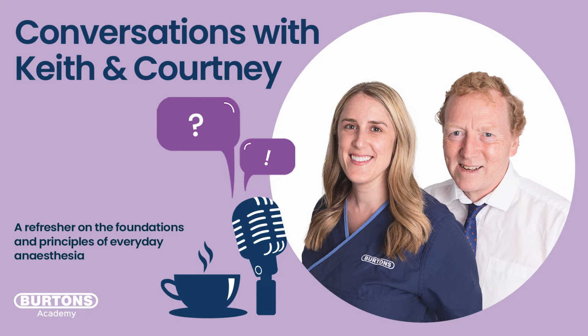Well, yes and no. It does very much depend on the patient involved and also the species. One of the things that we see with rabbits is that they can often be hypercapnic because traditionally they've been underventilated on something like T-piece systems, where the gas flow is too low for the minute volume of a rabbit. A lot of rabbits are running at a degree of hypercapnia. And if they're hypercapnic for 30 minutes during a castration or an exploratory or something like that, then at the end, when you take them off the anaesthetic, they remain hypercapnic.